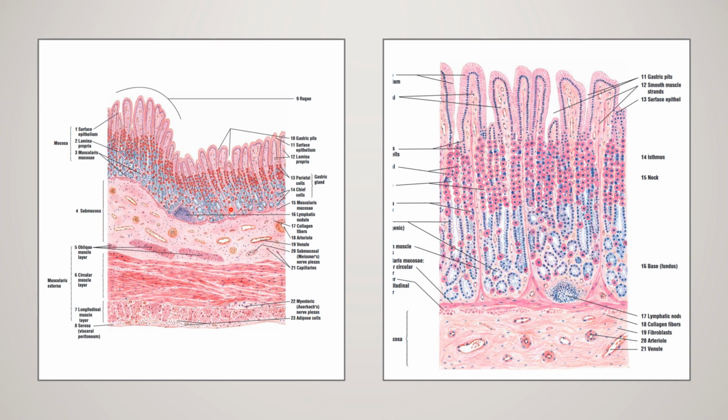The first important one is your parietal cells. Here you are able to make out, this is high power, a beaded appearance. That beaded appearance is due to the presence of parietal cells. What is the other name for parietal cells? Your oxyntic cells. Already you studied in physiology. What is the main function of these parietal cells? They secrete your HCl. That is the identification point for your fundus.